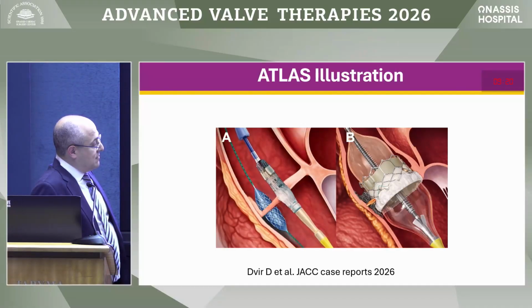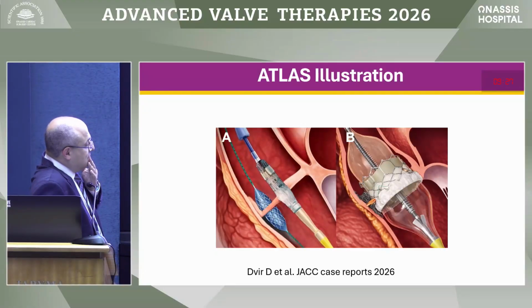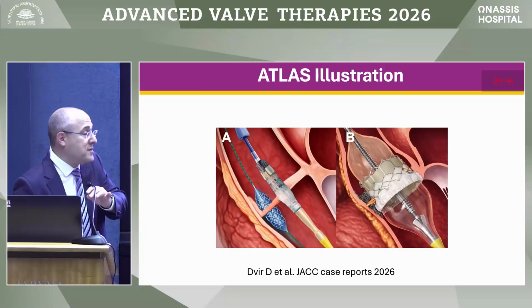No, because I'm worried that I leave there something that has a certain volume. And this volume might create a PVL in this place. So I don't see any advantage of doing this symmetrical, but it may add to the complexity of the procedure.